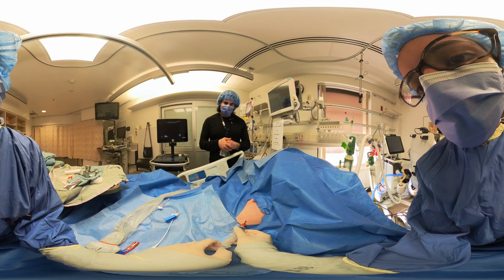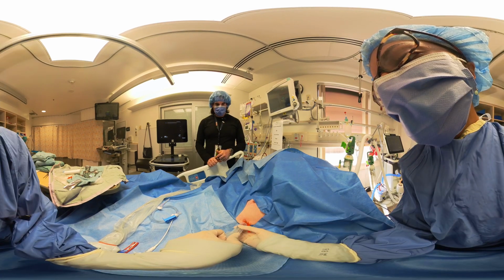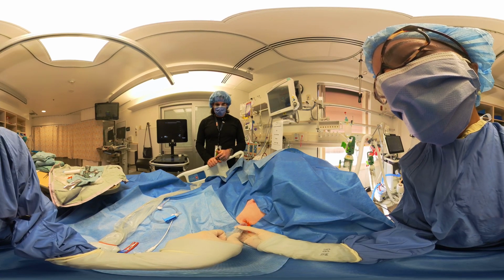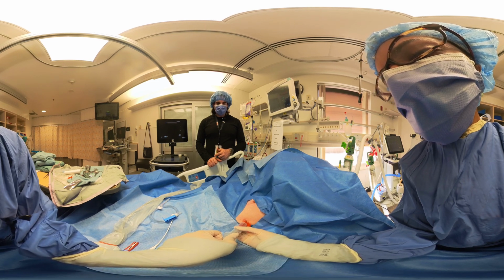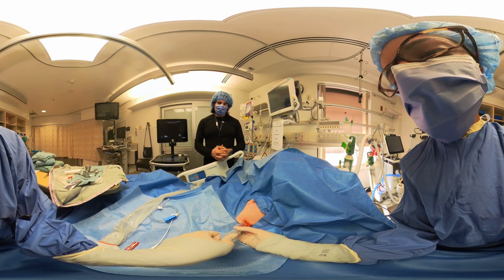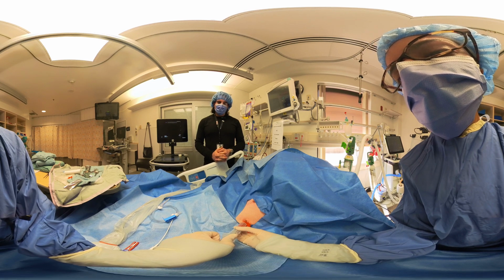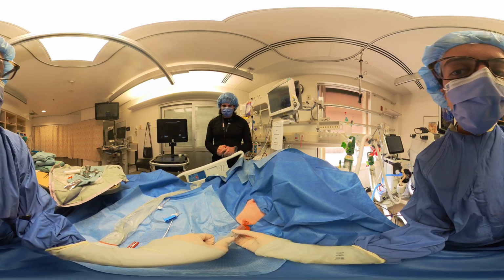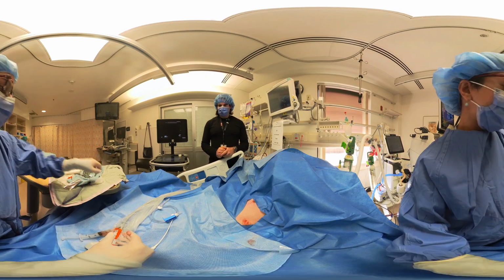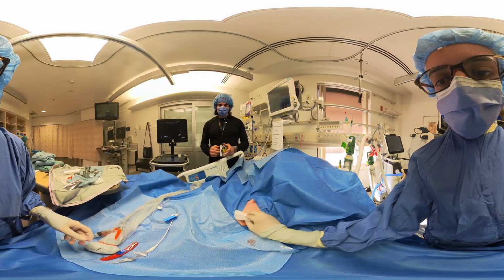Okay, keep going. There we go. Okay, keep going. Yeah, you got some fluid back. That's nice, nice and clear actually. So that's your trajectory that you'll follow with your bigger needle. Okay, so from here the needle will come out and you'll put some gauze over the area. So that's a nice trajectory.